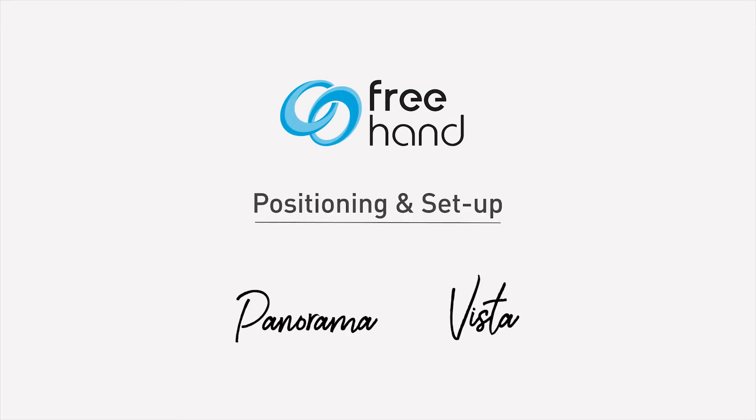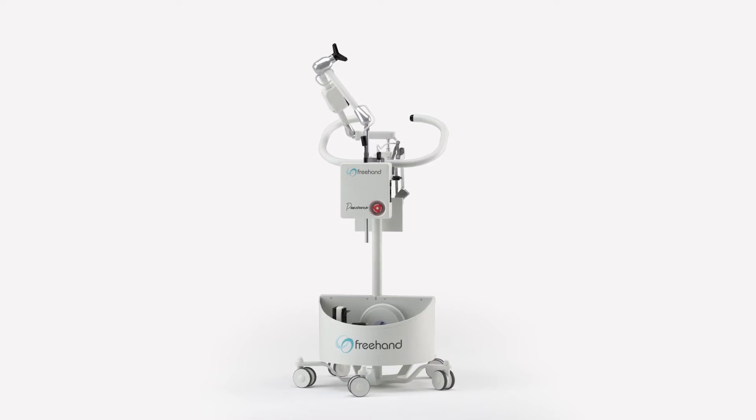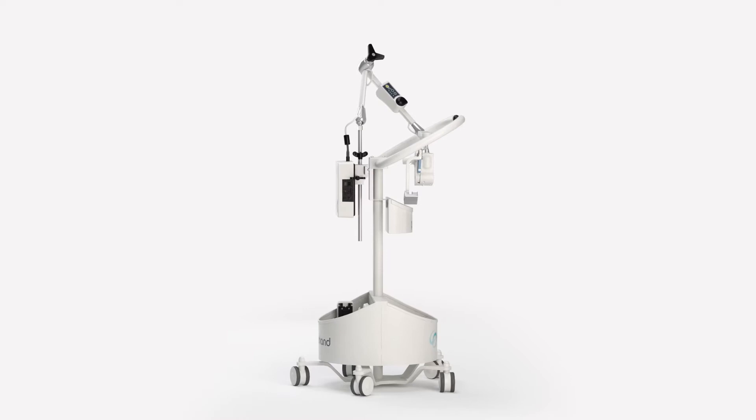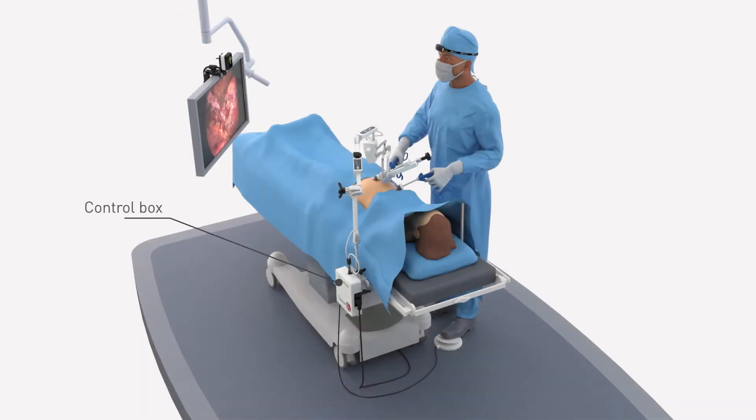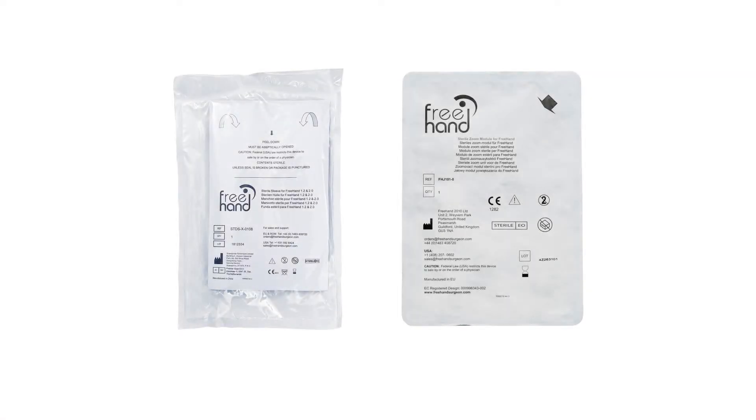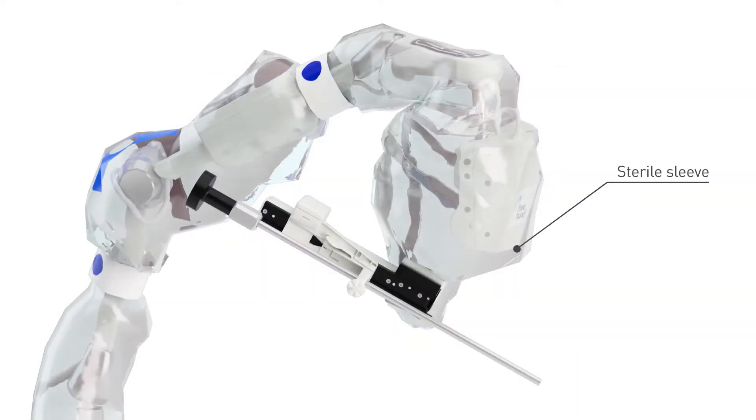The Freehand Collaborative Robot is made up of several items which, when not in use, are stored on the freehand cart. The control box powers the robotic motion assembly via the mains cable. The headset allows the surgeon to select the direction of scope movement. The foot switch moves the scope in the chosen direction, and the indicator unit displays the direction of scope movement to the surgeon. The Freehand Collaborative Robot works with a sterile patient pack made of a sterile sleeve to cover the freehand arm and a sterile zoom module to hold the scope.